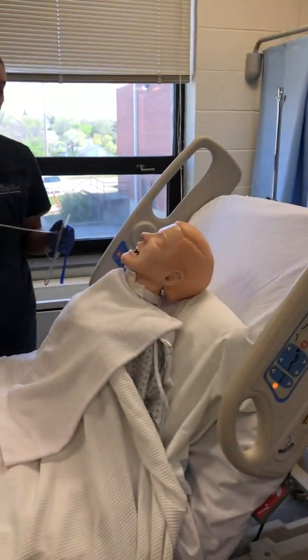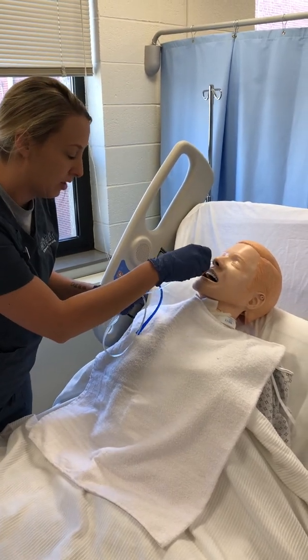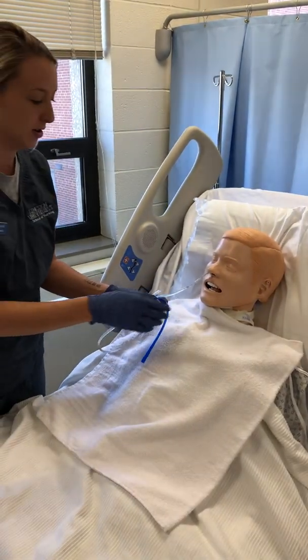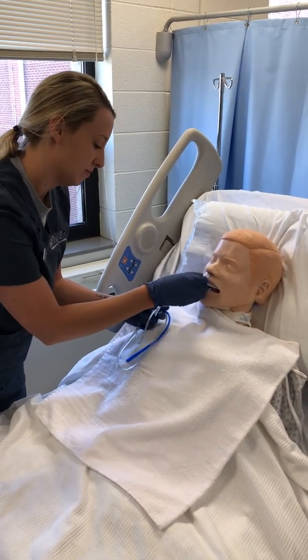Once I was ready, I tell my patient to take a deep breath and then insert it. Once I see it in the back of the throat, then I can have them lean forward, and I would have them have a water, and as I'm inserting, I would have them take a sip and then insert it to my marked area.